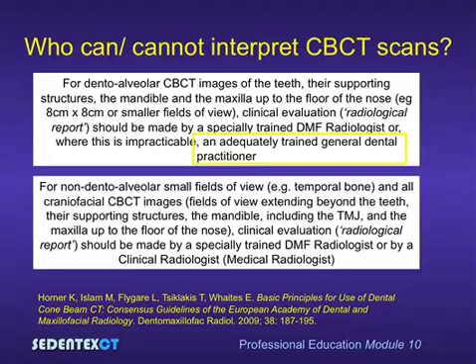For non-dentoalveolar small fields of view, for example temporal bone imaging, and all craniofacial cone beam CT images, where the fields of view extend beyond the teeth, their supporting structures, the mandible, including the TMJ and the maxilla up to the floor of nose, clinical evaluation should be made by a specially trained dentomaxillofacial radiologist or by a clinical radiologist.